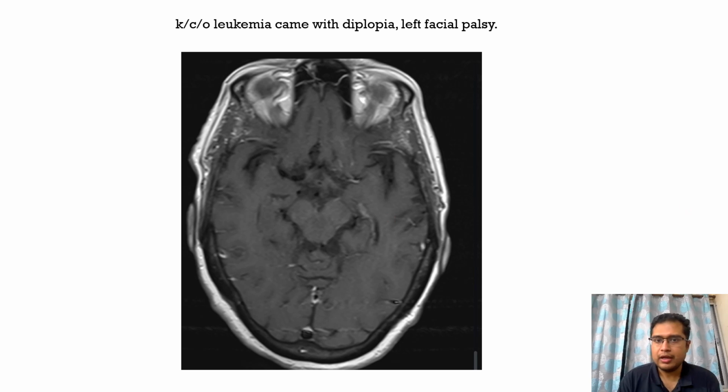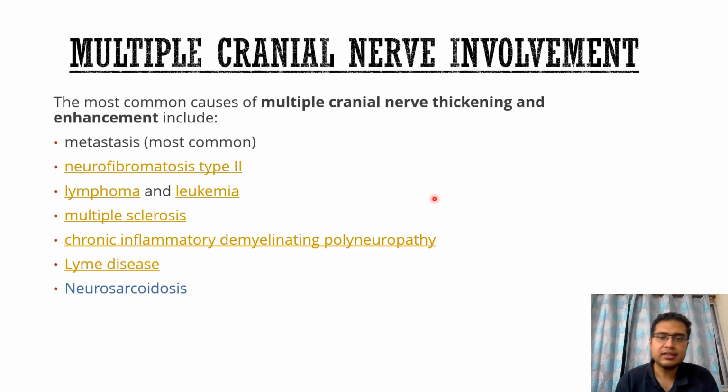that is seen. As I have discussed previously in one of the A Day With Me sessions about cranial nerve imaging, where I had presented a case of Bell's palsy which I had come across, it is always important to get a post contrast sequence done to look for enhancement of the nerves.